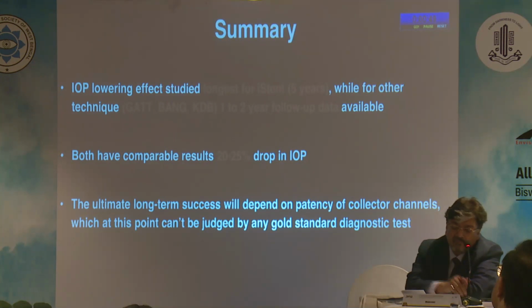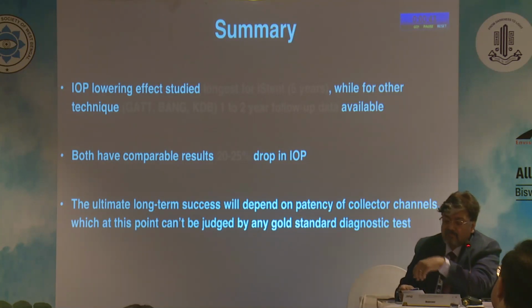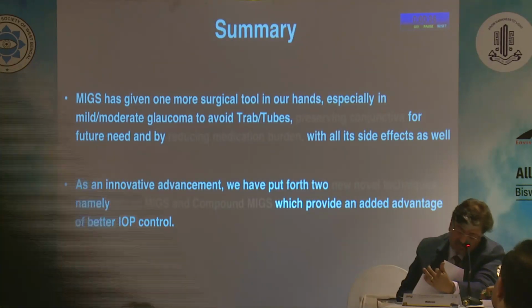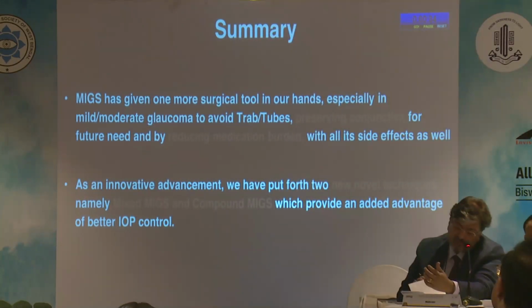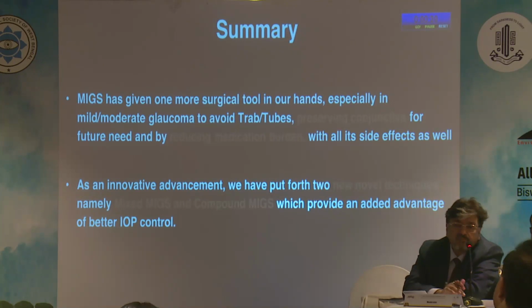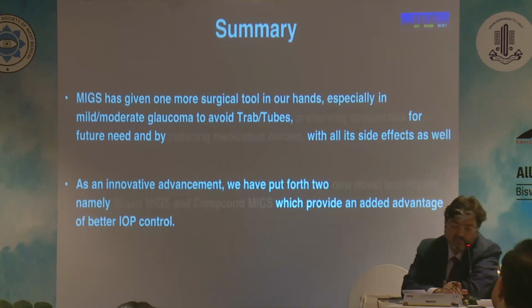The ultimate long-term success will depend on patency of collector channels, which at this point can't be judged by any gold standard diagnostic test. MIGS has given one more surgical tool in our hands, especially in mild or moderate glaucoma, to avoid trab or tubes, preserving conjunctiva for future need, and by reducing medication burden, with all its side effects as well. As an innovative advancement, we have put forth two new novel techniques, namely mixed MIGS and compound MIGS, which provide an added advantage of better IOP control.